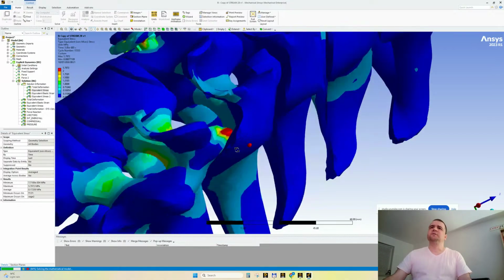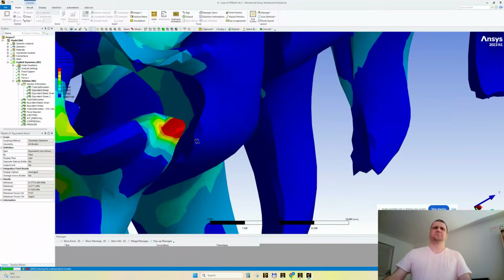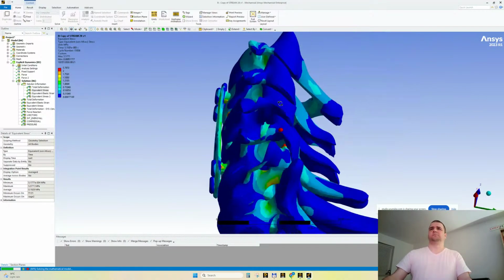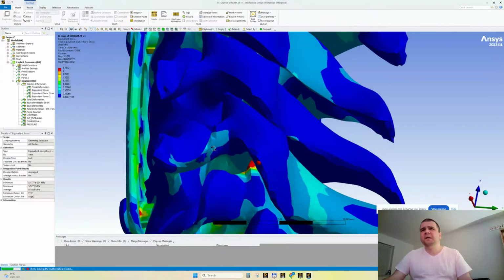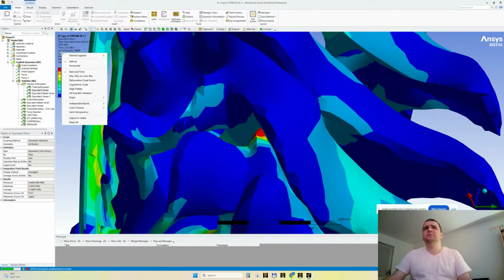Do we have a touching here? Yes, I think we have a touching. Huh? Maybe. No, but I don't understand why there is this maximum here.